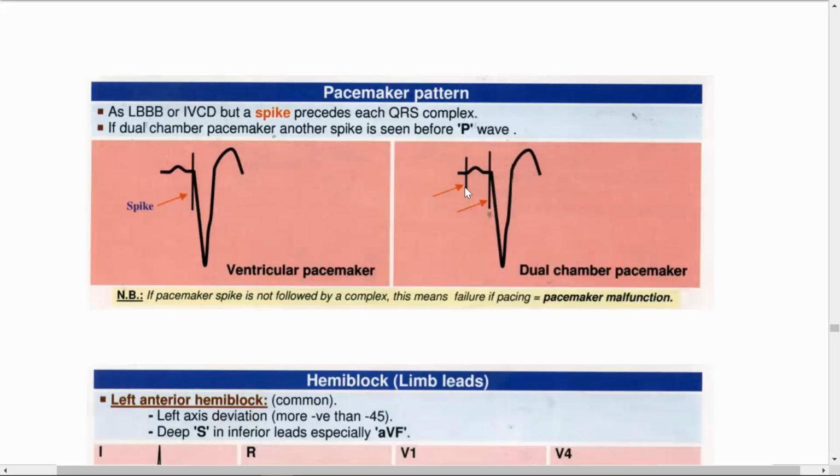The SA node sometimes goes to sinus pause, sinus tachy, sinus brady, sinus arrest. Right atrium. Yes, atrial. So we need atrial. We will not need a ventricular lead at all because the ventricular conduction is completely normal. So we'll need AAI or AAIR.